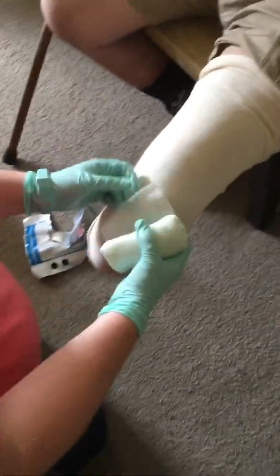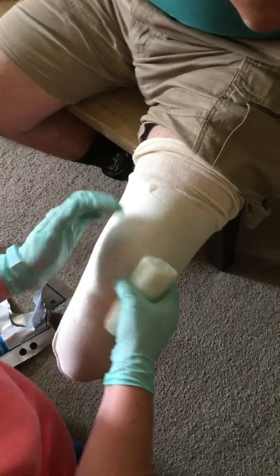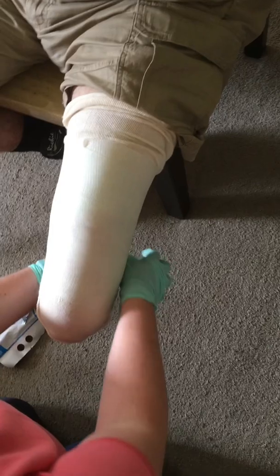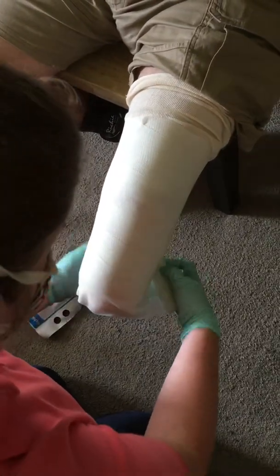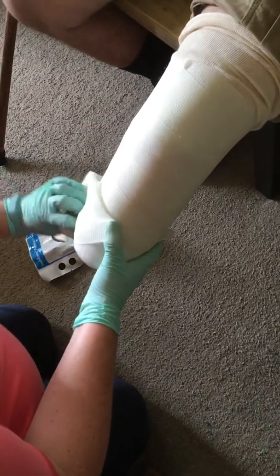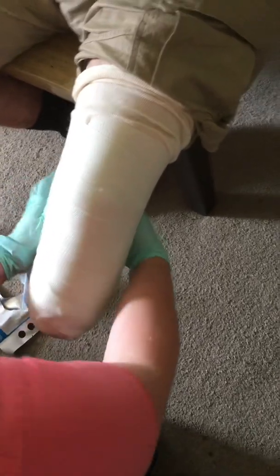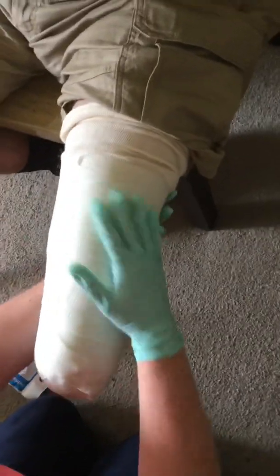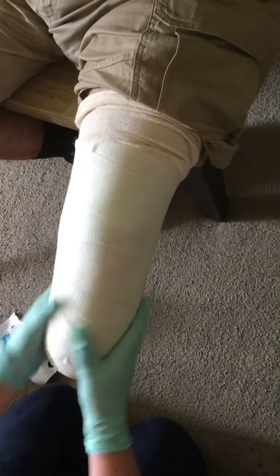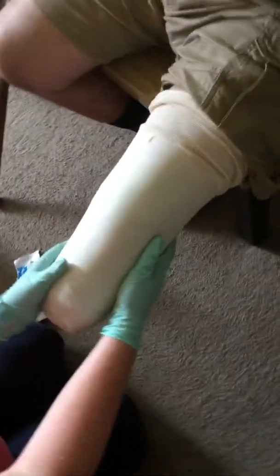One of the first tips is actually wrapping into the medial tibial flare. That will help you get the beginnings of that shape and also will move any soft tissue over on top of the tibial crest, which can always use some extra padding. We always wrap proximal to distal because that will help pull that soft tissue down and create a little bit of elongation, then continue wrapping until you get to the distal end. The amount of tension you're going to be putting in your casting material is very low — too much tension can cause roping and not enough won't give you a good shape. Just slight tension is all you need, and after you've wrapped the distal end continue to wrap until you use up all your casting material. Once you've done that, instruct your patient to fully extend their residual limb and start working the material, making sure it's all smooth with no large abnormalities.